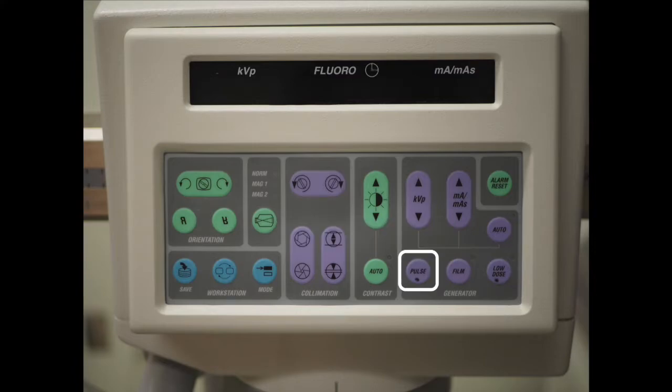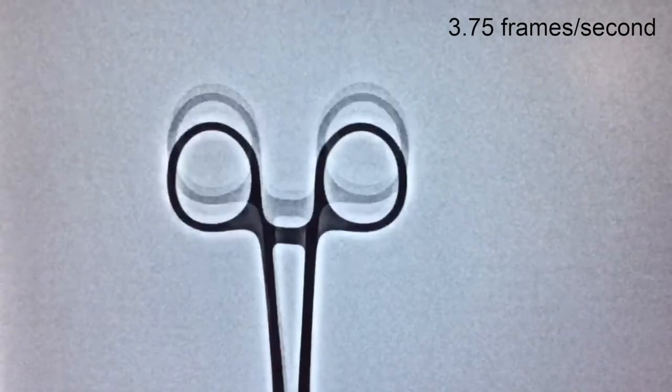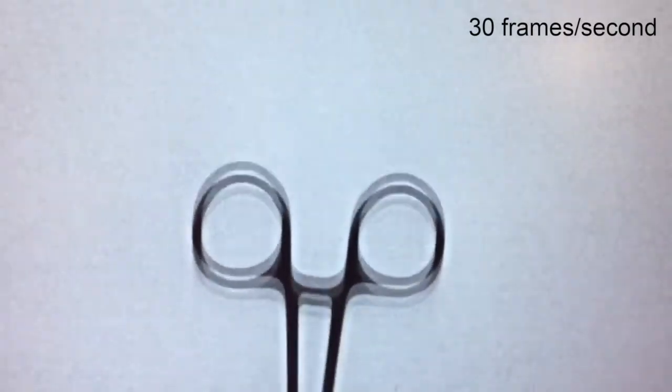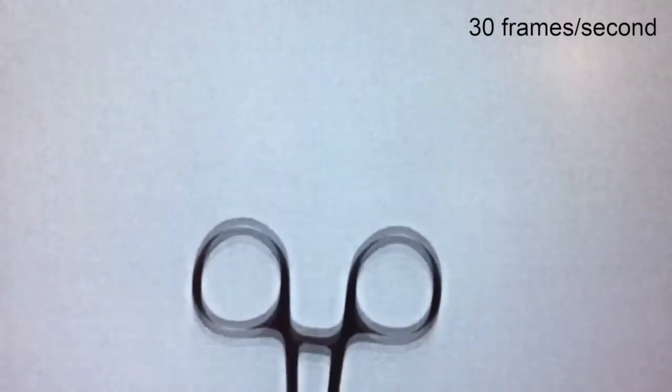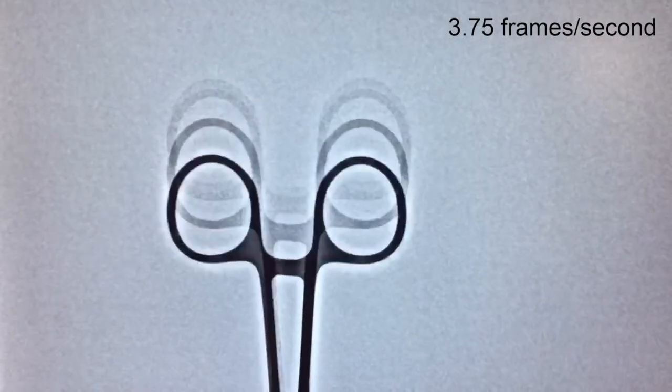Additionally, pulse dose fluoroscopy should always be used. Instead of emitting a continuous X-ray beam, the fluoroscope emits intermittent, short pulses of X-rays. The typical settings include 30, 15, and 7.5 frames per second. Decreasing the number of frames per second makes for a choppier image, however dramatically reduces the radiation dose. It's best to choose the lowest pulse dose needed for an adequate image.